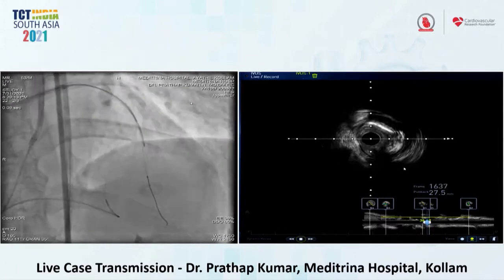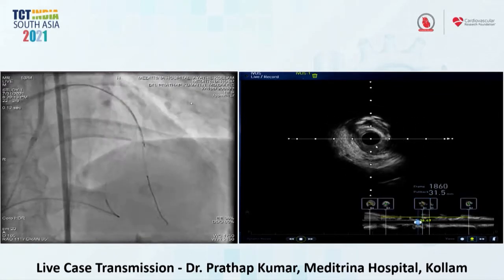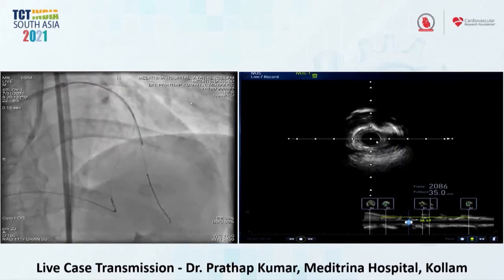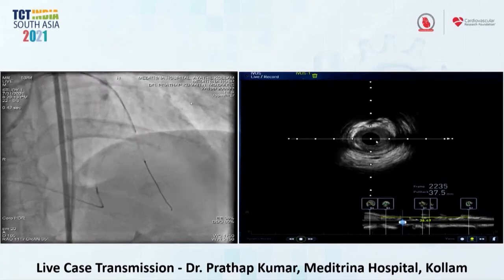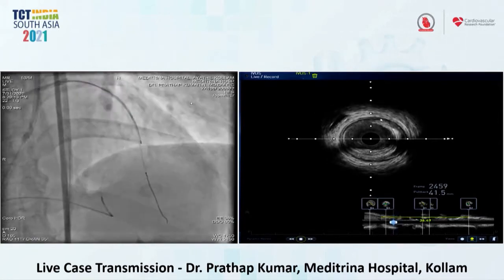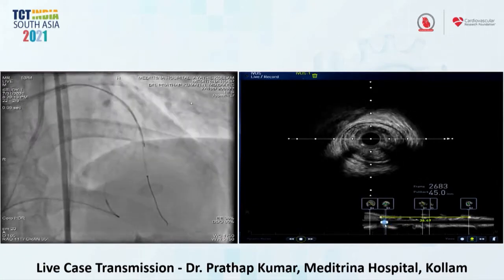And I think this is a part of the CTO. The CTO is almost like a fibrocalcific CTO, a long-standing CTO. We can see some minimal dissections, probably because of the balloon dilatation or maybe because of the previous intervention, we don't know. Yeah, again it's a mixed fibrocalcific plaque extending almost reaching near the ostioproximal part. Yeah, here the vessel looks almost like 3.5, and distally the vessel is only 2.75. Yeah, and the plaque is extending.